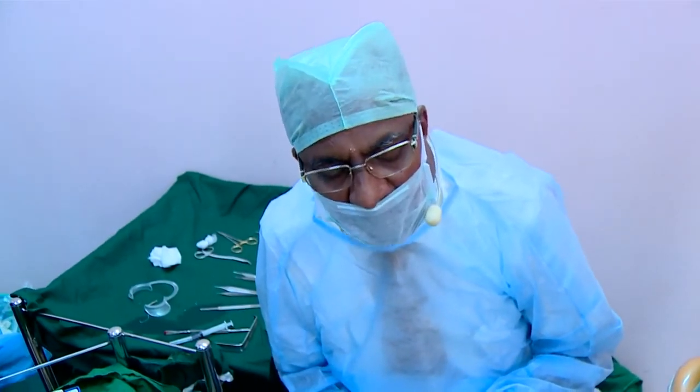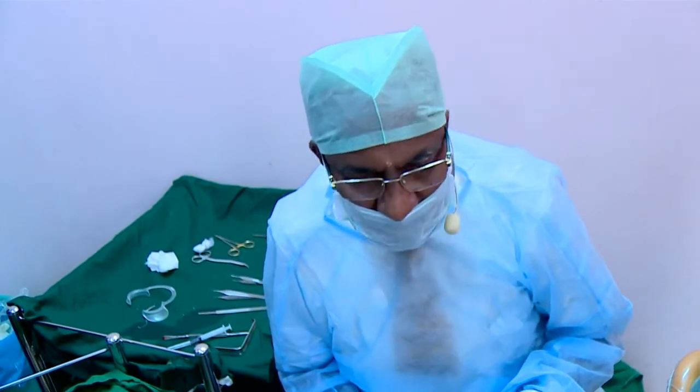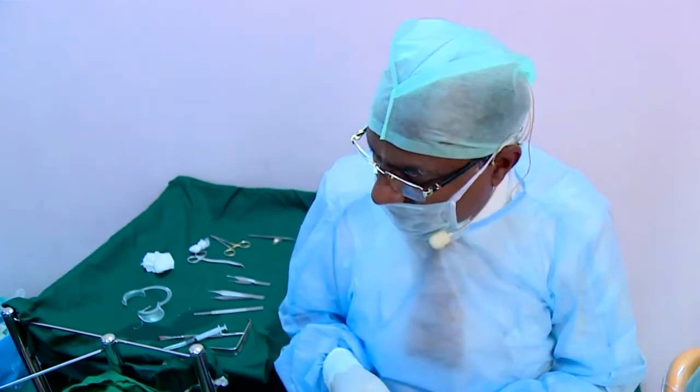So I am going to start with the under-drilled osteotomy site. I'll see whether I can drive in my implant. If I feel that I can't drive in my implant, I'm going to reverse it back and go for the next drill, because the next drill is going to be exactly the right fit for the implant size. Am I clear or should I explain any more? Is everybody clear on this?